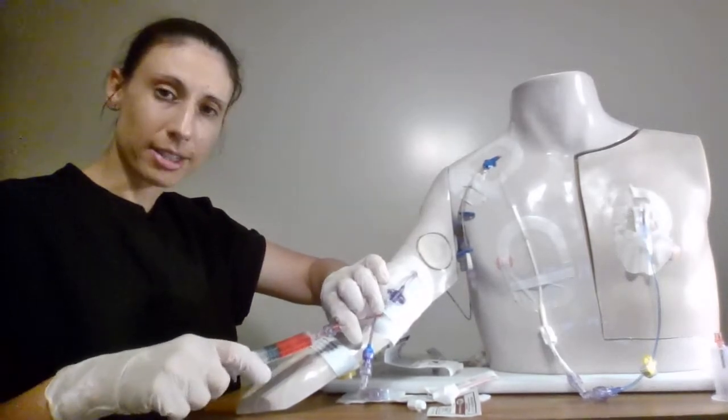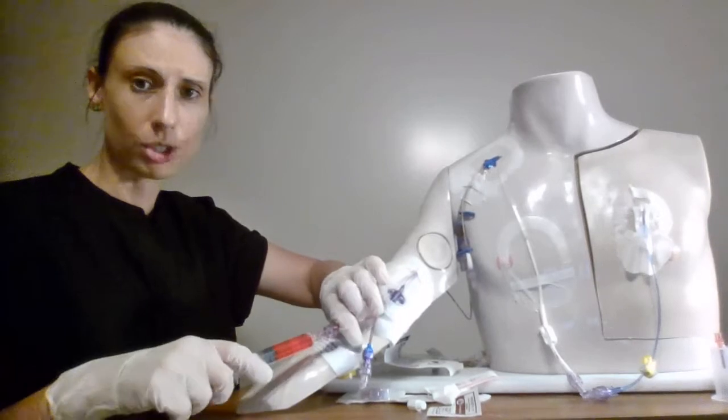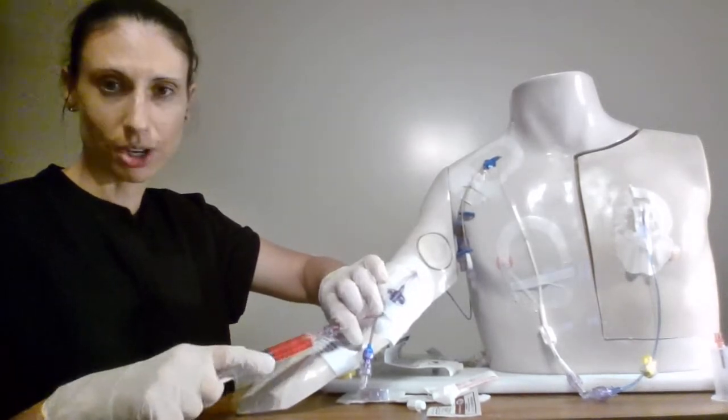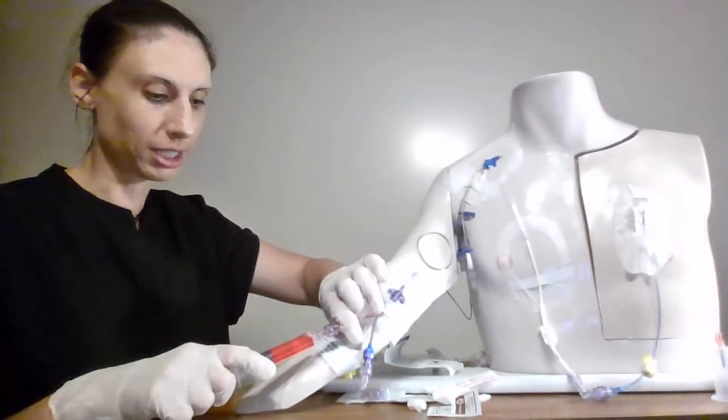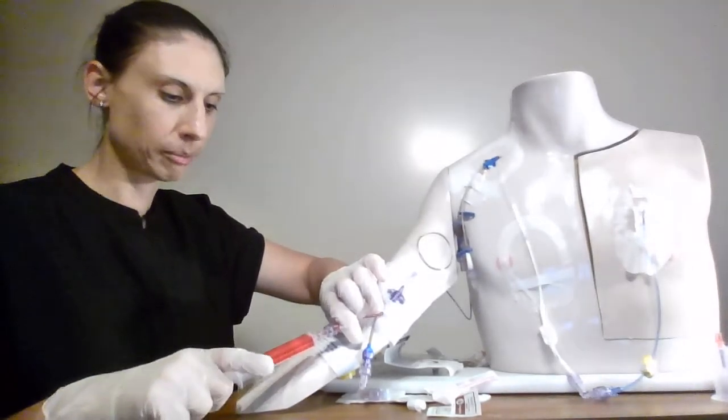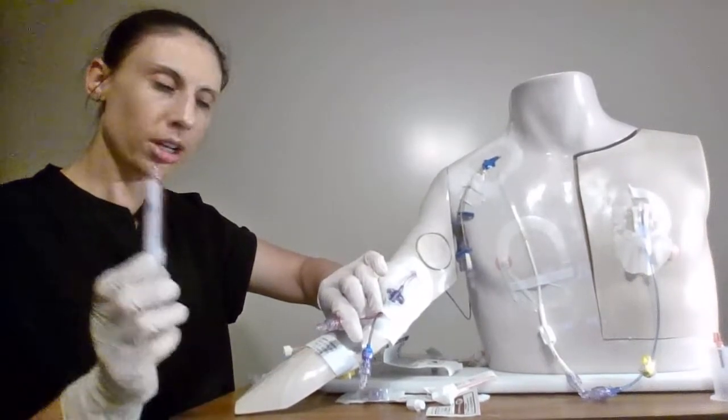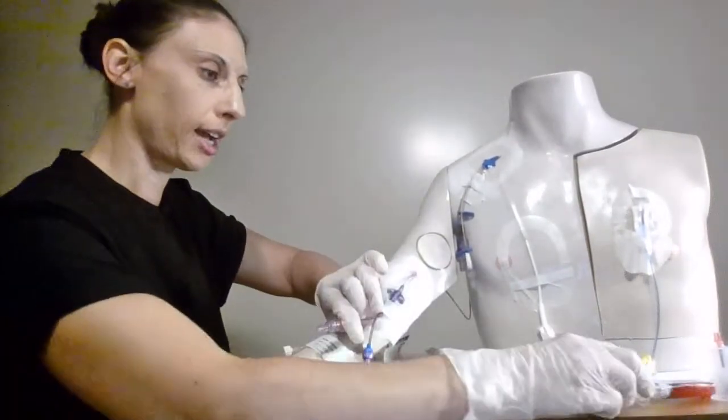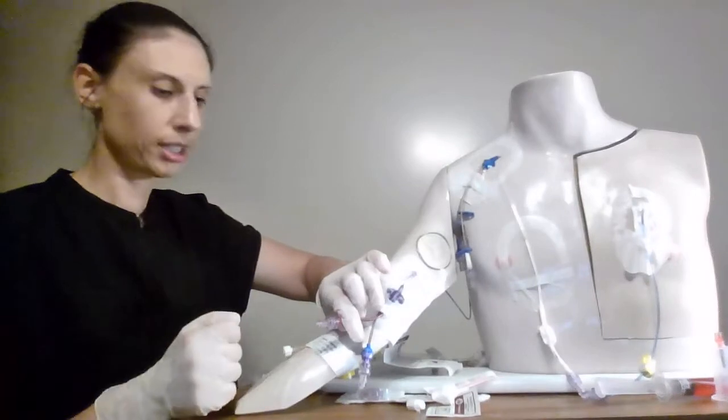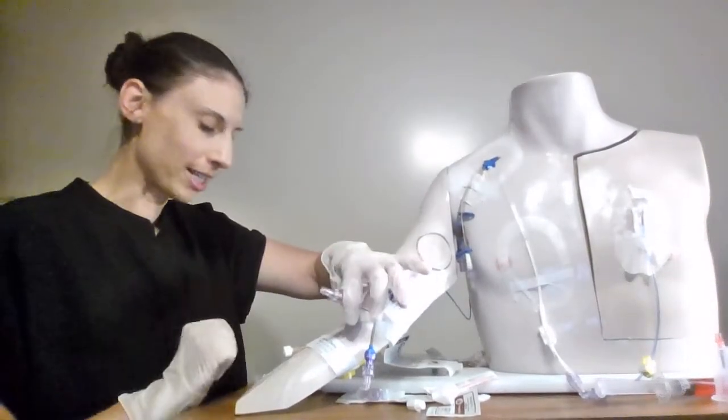So minimum six cc is what I'm going to pull back however remember PICs are a little bit long so we can always draw a little bit extra to make sure that our sample is not contaminated. So you could even draw up to about eight or ten cc's. So once I've taken my discard I'm going to throw that into the appropriate container like sharps container and since there's no clamps there's nothing to clamp I can just take that right off.